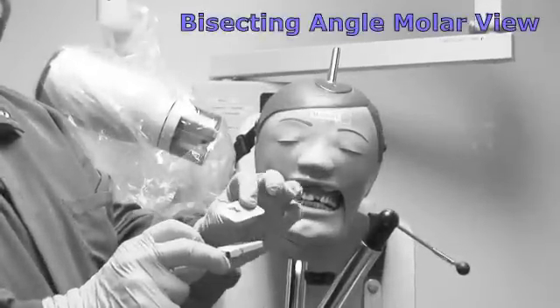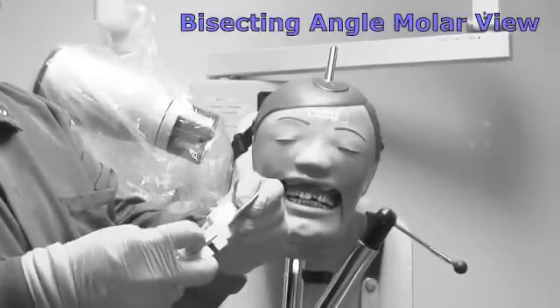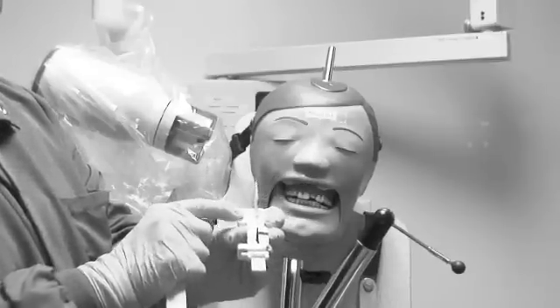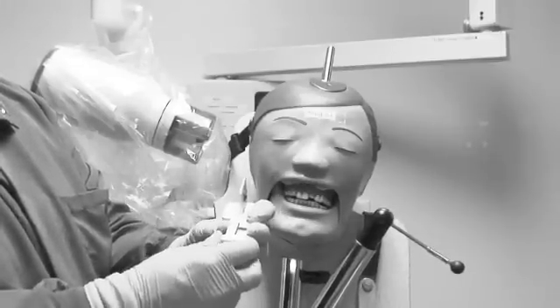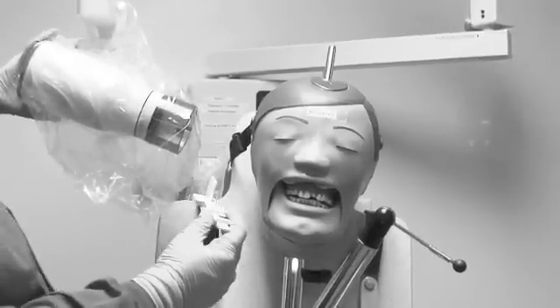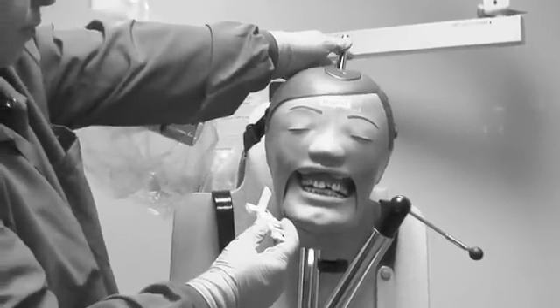When using the snap array, we're going to put the dot into the scissor-like slot, having it even with the bottom of the holder. We're always going to have the patient bite on the widest side of the bite block for stability, then lock it in. I've already set my plus 20 to 25 for the molar view.